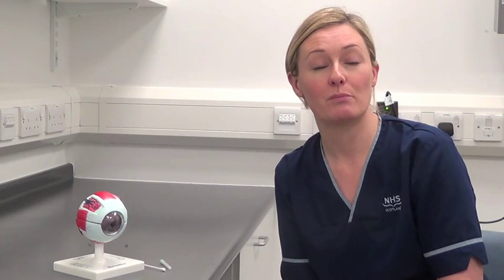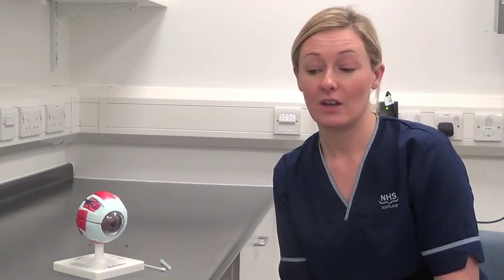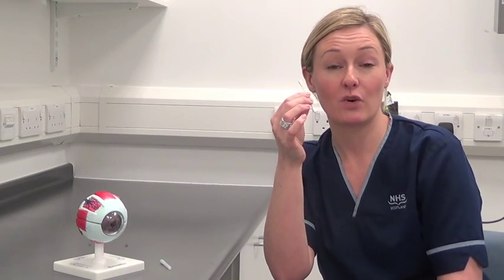The other area you can get a foreign body is on the subtarsal plate, and if you remember I demonstrated eversion of the upper lid in the first film. Using a cotton bud, you simply wipe over the subtarsal plate to remove any foreign body there.